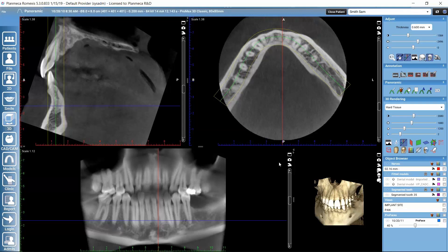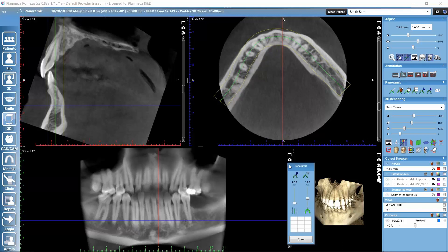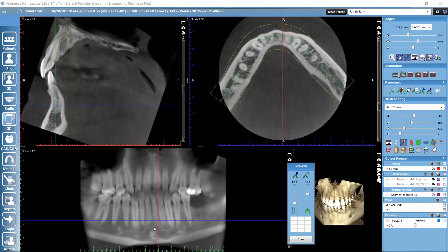Here we can also adjust the panoramic slice thickness. The green plane is the focal plane, and the slice thickness of the panoramic curve is shown in yellow. Opening the viewport settings lets us adjust the thickness — we can see that increasing it adds more information to the panoramic view. There is also an automatic enhancement option for the panoramic curve that adjusts the contrast and sharpness.